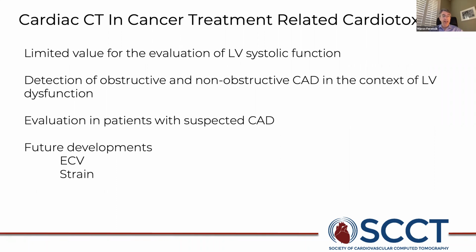Now, CT has very limited value for the evaluation of LV systolic function, only when MR or echo are not feasible for whatever reason. It's mostly the detection of obstructive and non-obstructive CAD, whether in the context of LV dysfunction or symptoms, that leads to this evaluation. There are areas of future development that we discussed a little bit in the guideline, extracellular volume and strain, but they are not ready for clinical practice.